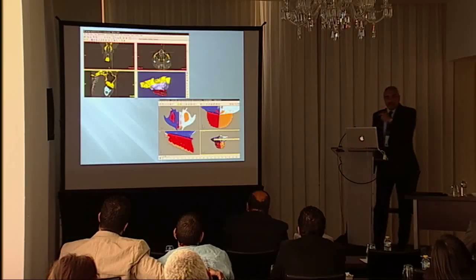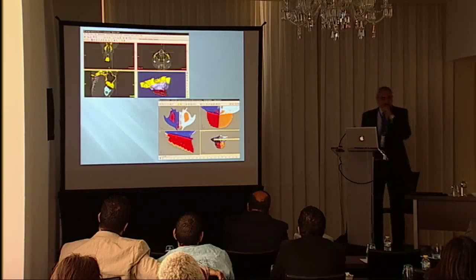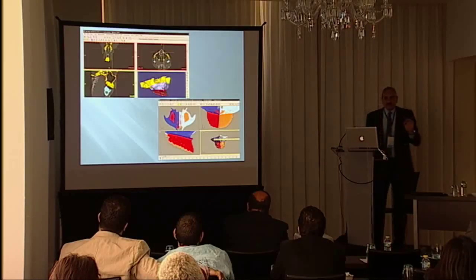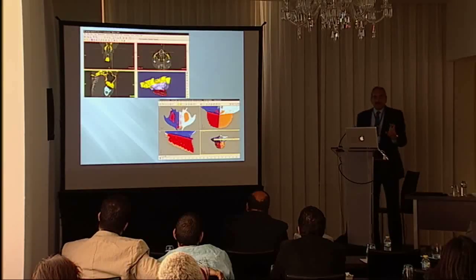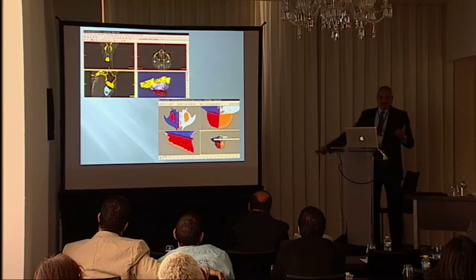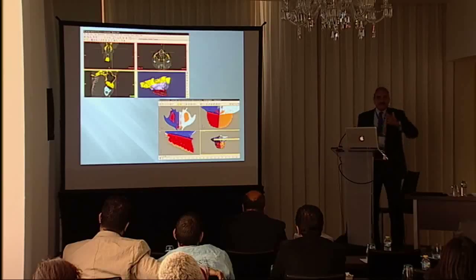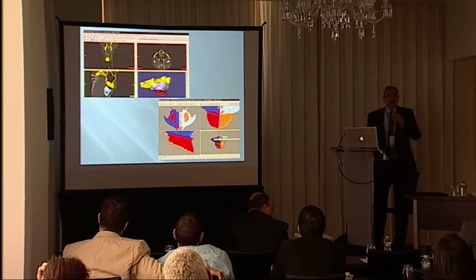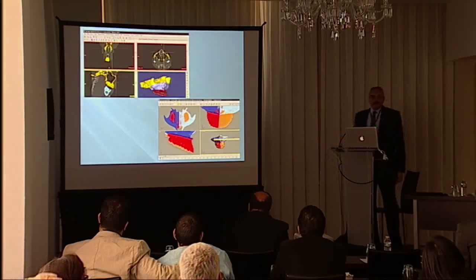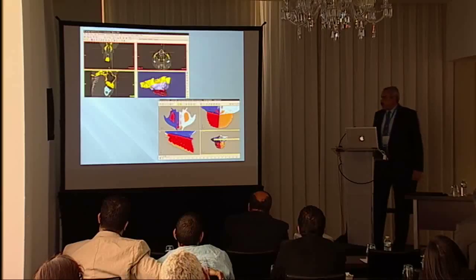And by the way, I don't remember the date exactly now, but that was the first computer-guided splint to guide the maxilla in impaction position. We had splints before that one that guide the maxilla forwards, backwards, tilting, and rotating right and left, but there were no computer-guided splints that guided the maxilla in impaction or in vertical position before that one.